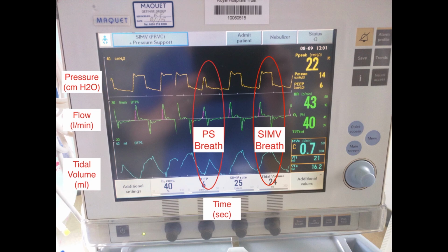Okay, just a couple more things to point out on the graphs. The middle graph of flow against time is particularly useful if you think your patient's had an unplanned extubation and you're trying to work out, is my endotracheal tube still in the trachea? As I mentioned, time is along the bottom, along the x-axis, and you've got flow against the y-axis. Above the x-axis, you've got inspiratory flow. Below, you've got expiratory flow. So you can see there, the graphs are fairly symmetrical. The flow going in mirrors fairly well the flow coming out.